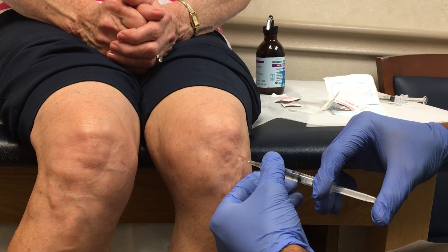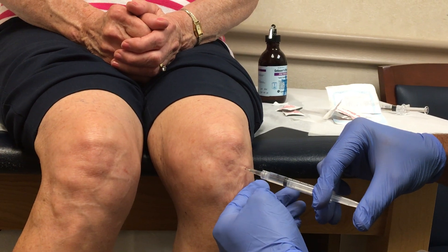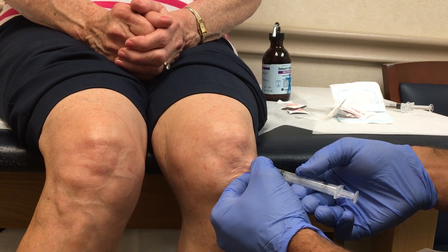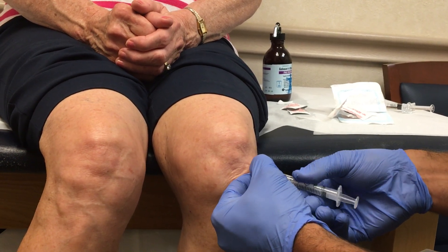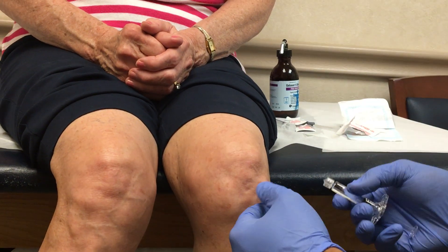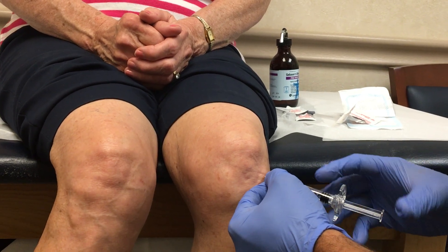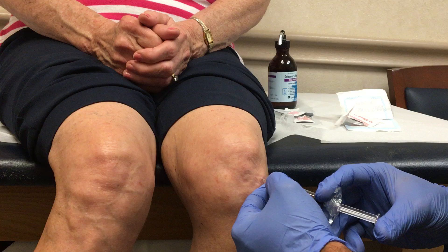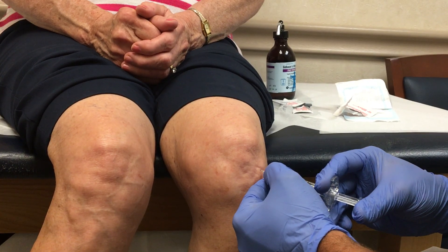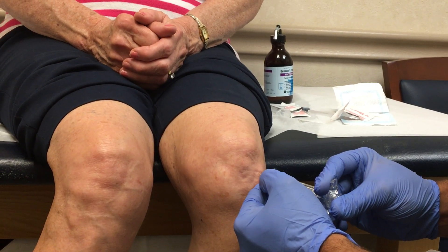So I keep entering, and right there I feel a loss of resistance. That confirms I'm in the joint. If I didn't have that loss of resistance, I could also aim towards the lateral femoral condyle, and with the bevel down, just tap the femoral condyle — and once you come in contact with the lateral femoral condyle, you know you're intra-articular as well.